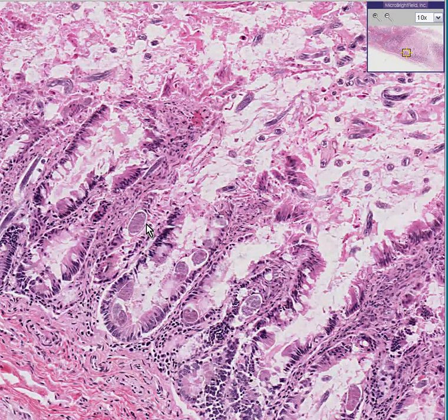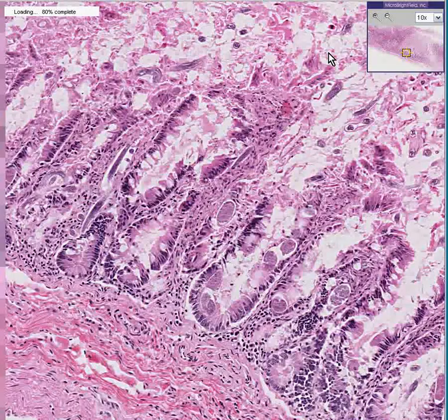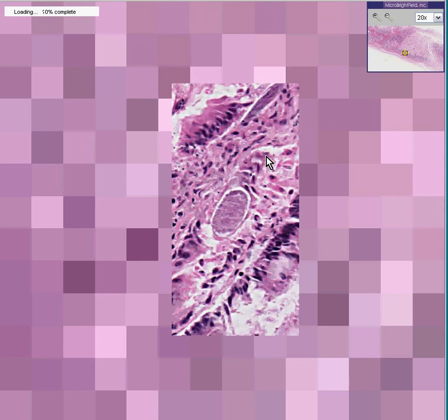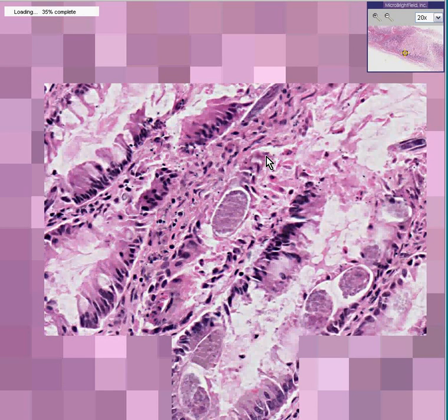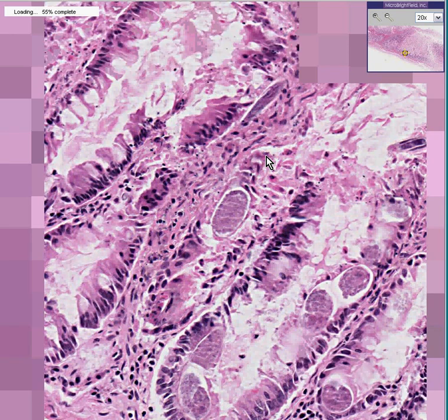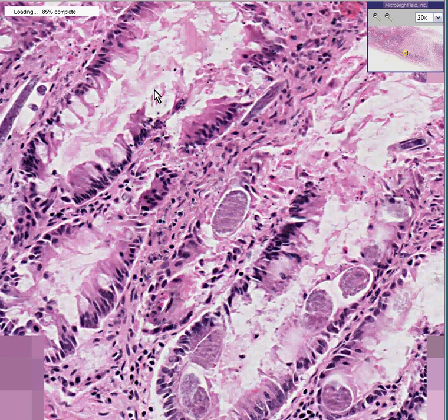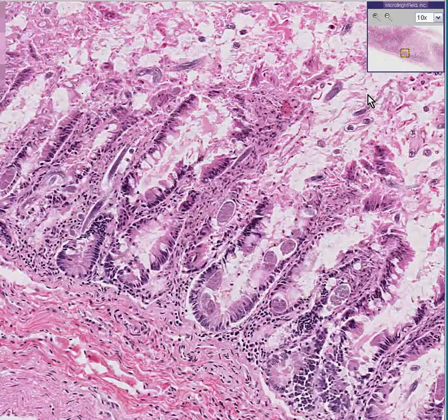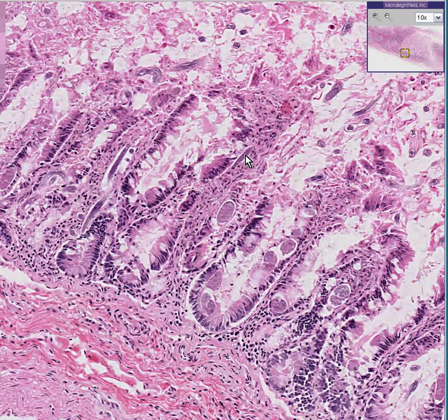What doesn't look right is that you should not see structures like this within the mucosa of the small bowel. Furthermore, it doesn't look like anything we've ever seen. Whenever you see some type of tissue or stainable substance that doesn't look like anything you've ever seen, maybe it's something that shouldn't be there. These are worms. Here is a worm that is cut on cross-section, and here's a worm that is cut more longitudinally.